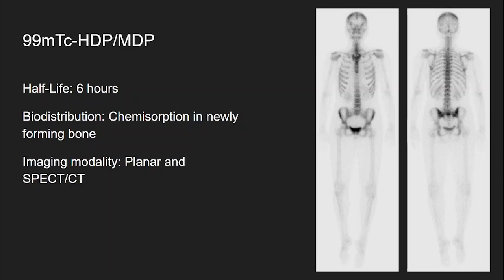The radiotracers can be imaged using either planar or SPECT/CT imaging techniques. While commonly used for bone pathologies, the radiotracers can also localize to other tumors, including meningioma.